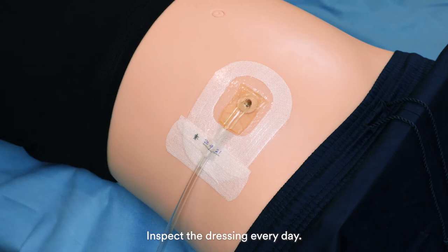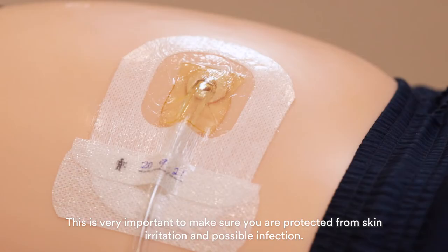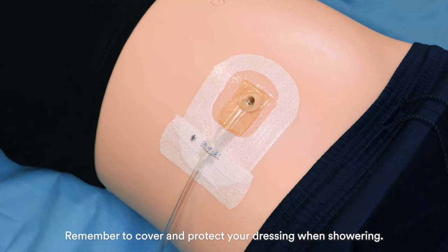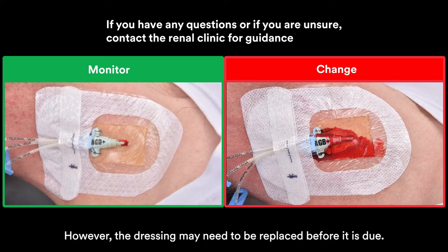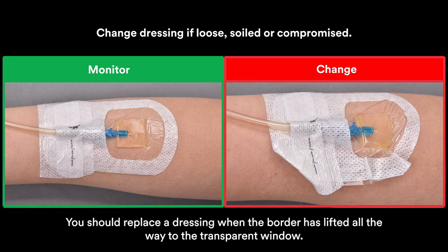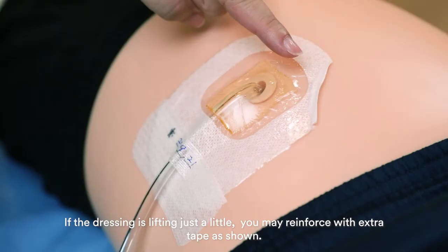Inspect the dressing every day. This is very important to make sure you are protected from skin irritation and possible infection. Remember to cover and protect your dressing when showering. The dressing can remain for up to seven days. However, the dressing may need to be replaced before it is due. If the dressing is visibly dirty or wet, contact the renal clinic for guidance to determine the need for a dressing change. You should replace a dressing when the border has lifted all the way to the transparent window. If the dressing is lifting just a little, you may reinforce with extra tape as shown.